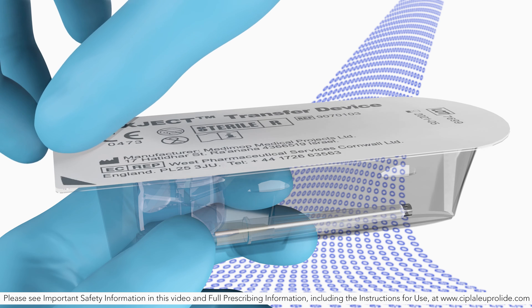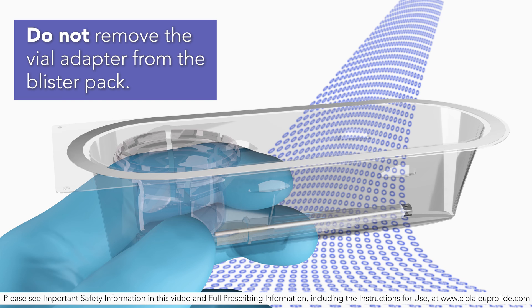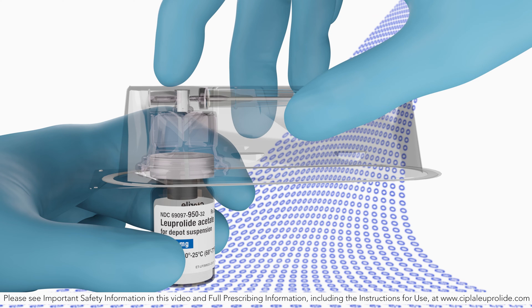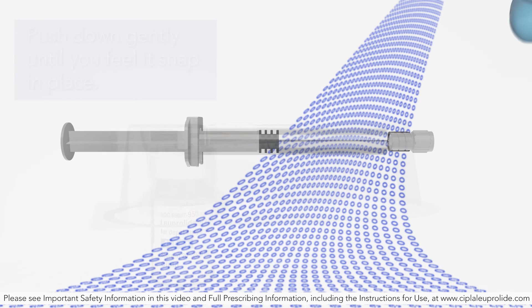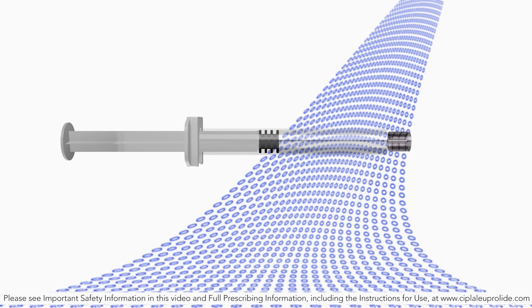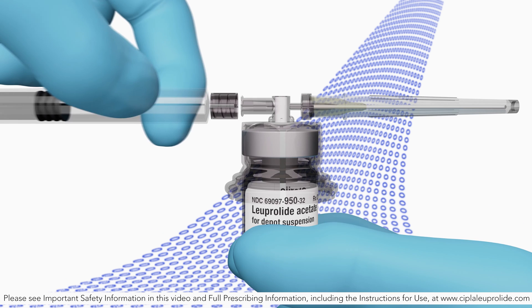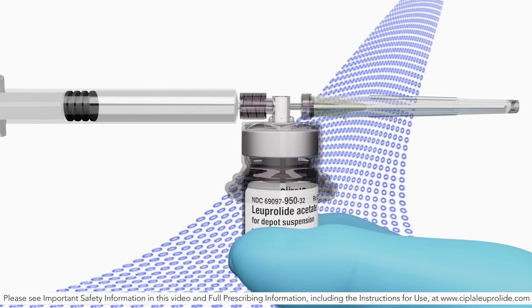Peel the cover away from the blister pack containing the vial adapter mix-ject. Do not remove the vial adapter from the blister pack. Place the blister pack containing the vial adapter firmly on the vial top, piercing the vial. Push down gently until you feel it snap in place. First, remove the cap from the syringe barrel, and then remove the blister pack from the vial adapter.